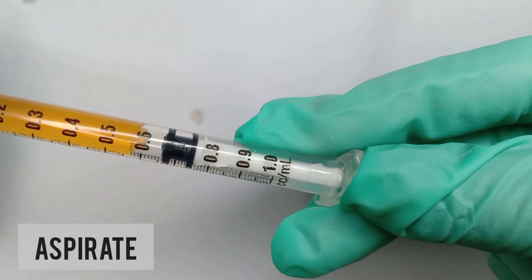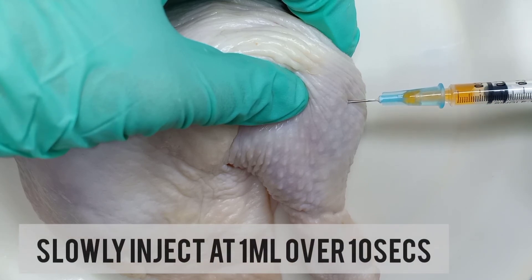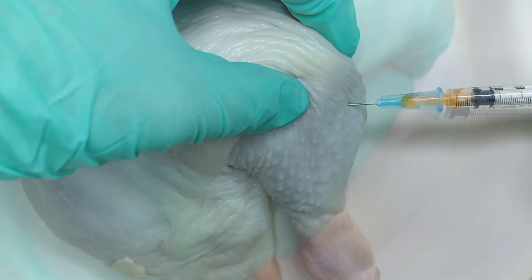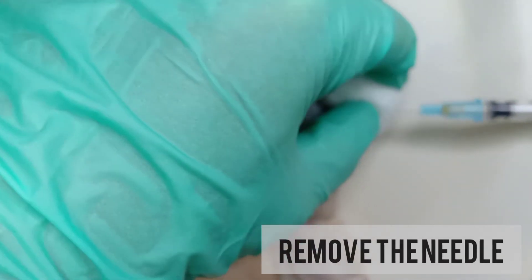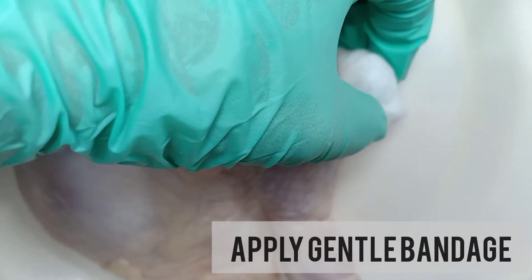Remove the needle if blood is aspirated. If there is none, then slowly inject the vaccine at a rate of 1 ml over 10 seconds. Prepare a cotton and remove the needle. Apply gentle pressure to the site, and then apply the bandage.